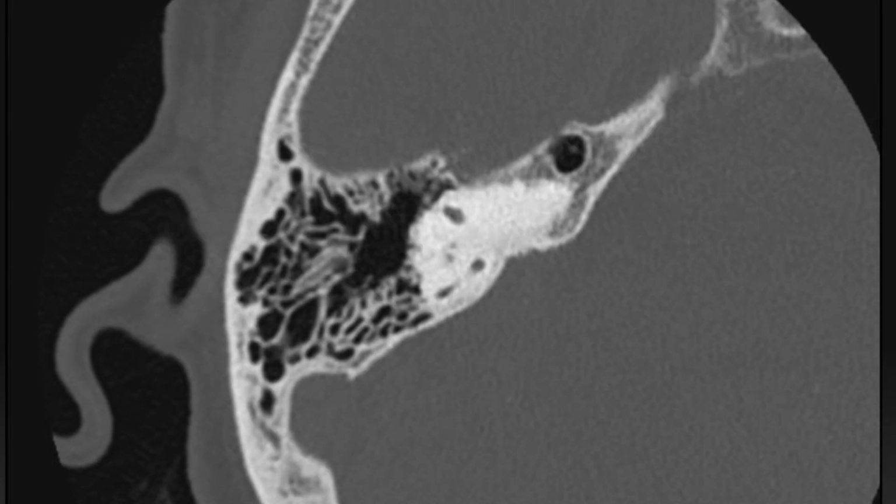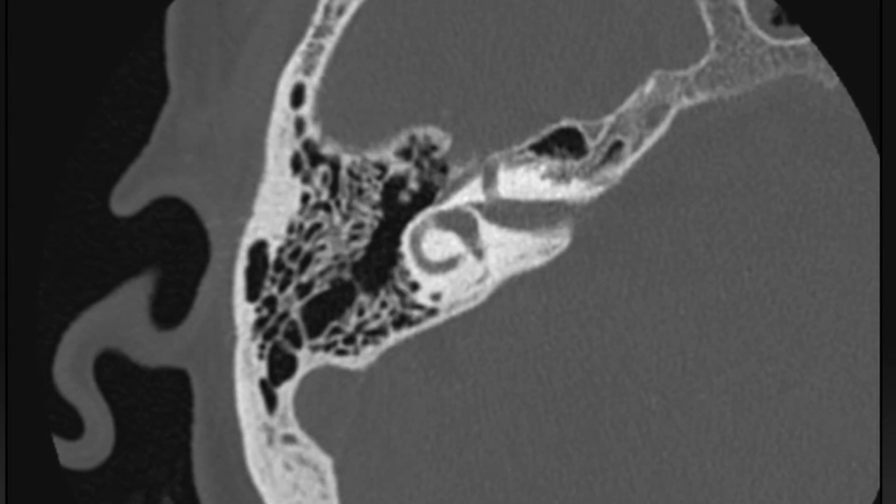I have a practical question in terms of accurately measuring the ATVA. You want to be on an axial image that is parallel to the plane of the lateral semicircular canal. And at what level are you actually measuring this? And where do you draw your lines? Yeah, we talked about our methodology in our paper, but I will show you this CT scan. This is as if we're scrolling through a CT. So you can see that we want to only look at CT axials when it's reformatted so that it's parallel to the plane of the lateral canal. And that's not only for the purpose of measuring ATVA, it's for all comers. You just always want a standardized way of looking at axial CT temporal bones.